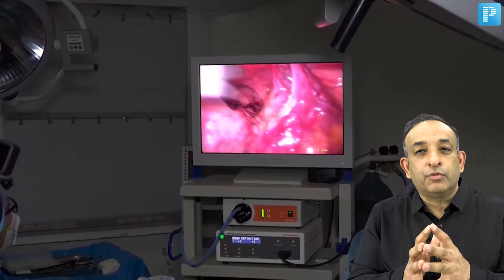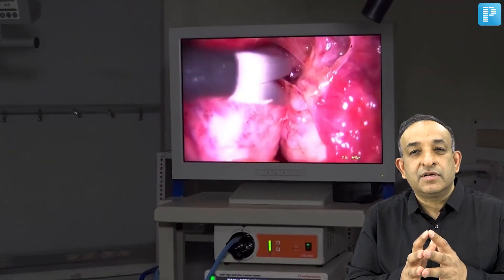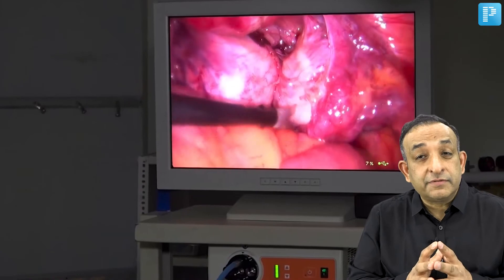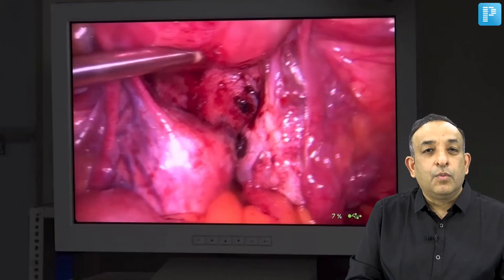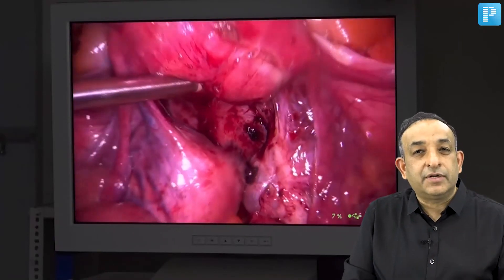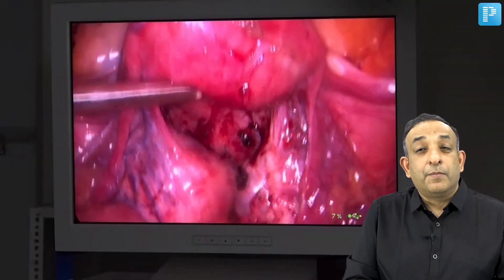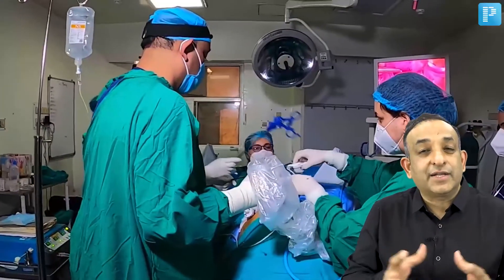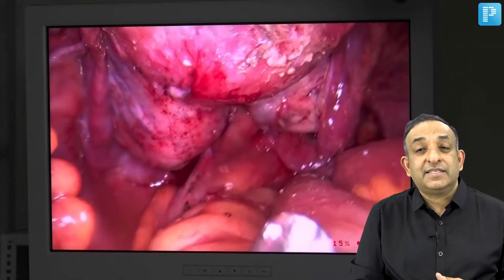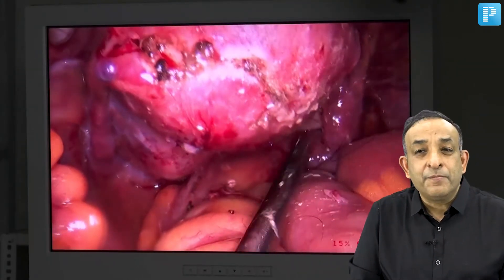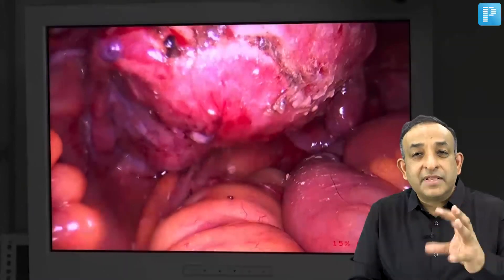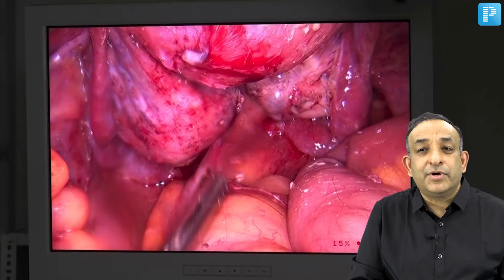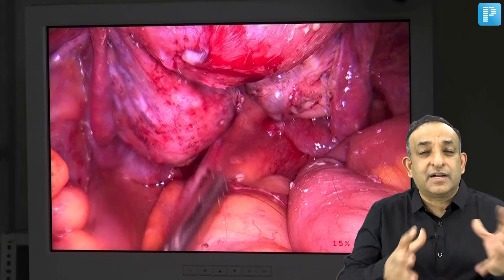Finally, I got the right fallopian tube free of adhesions, releasing it from the posterior uterine surface and the right ovary surface. After freeing the tube, I found that both ovaries were attached deep into the pelvis against the posterior uterine surface. On removing those adhesions from the right ovary, I discovered a small, undiagnosed dermoid cyst in this patient.